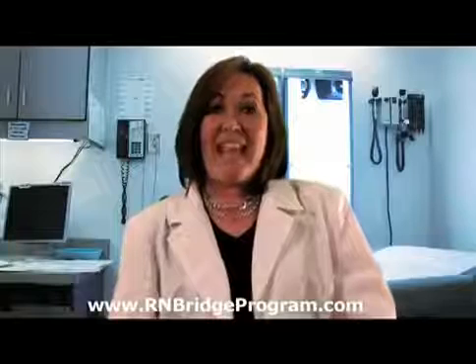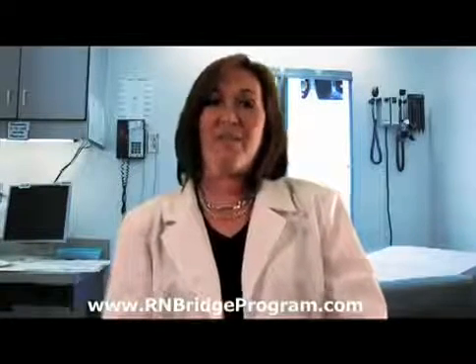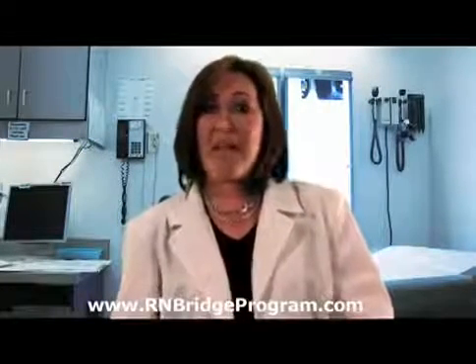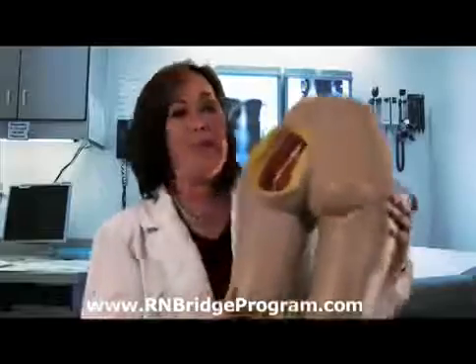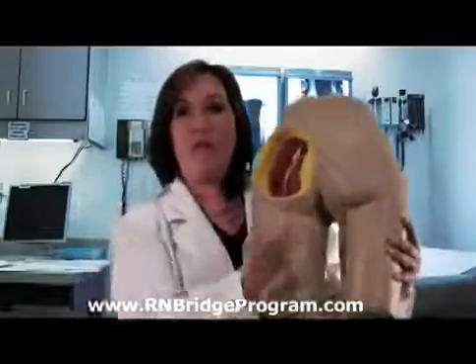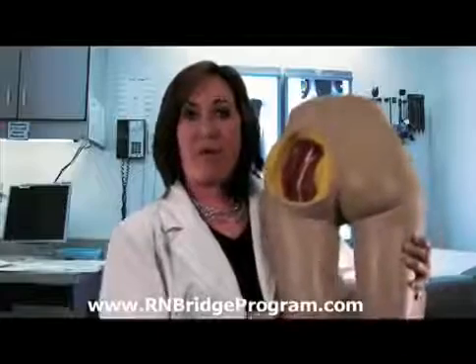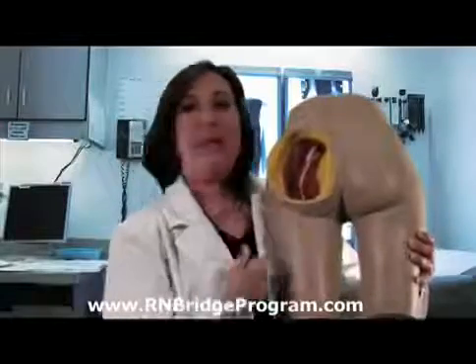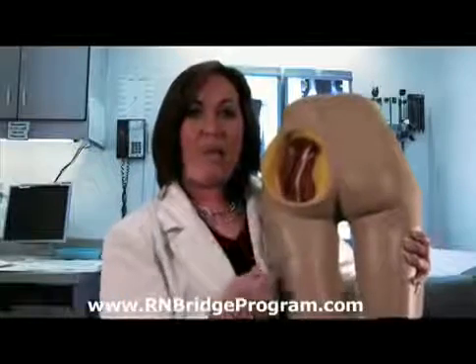Today I'm here to talk to you about an intramuscular injection that's going to be going into the gluteal muscle. So we're going to talk about how to give the injection and our appropriate landmark for that specific IM injection. Now here I have a model of the patient with the gluteal muscle, and here you can see the gluteal muscle is exposed, also showing to you the sciatic nerve that runs directly in the middle of that muscle.